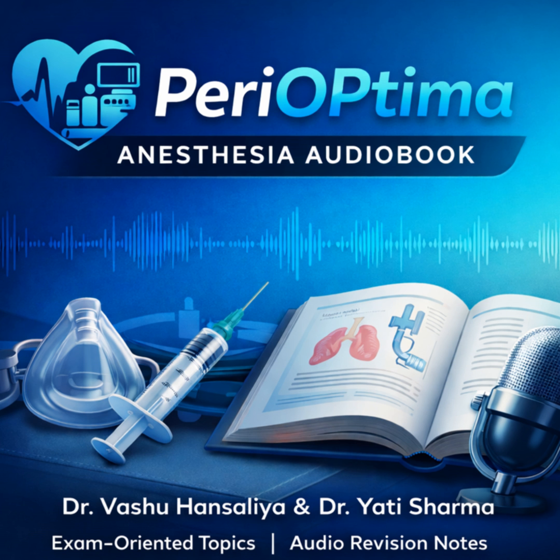Systolic unloading. The balloon deflates just before the heart beats. Imagine the aorta is pressurized from the balloon inflation. Suddenly, the balloon collapses. This rapid removal of 40 or 50 cc's of volume creates a sudden drop in pressure in the aorta. It's like a vacuum effect, or a sinkhole, if you will. We call this the end diastolic dip.